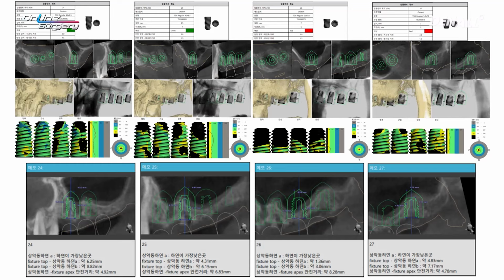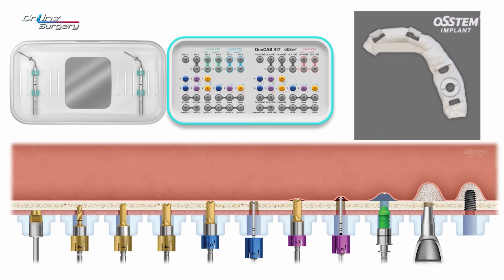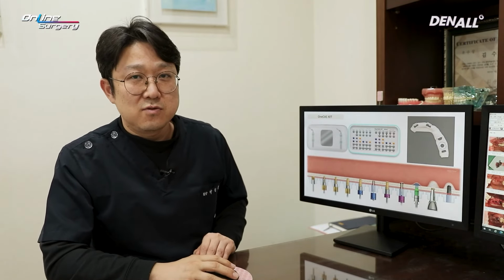If you look at the guide design, this shows everything we need to know about residual bone. This shows the minimum and maximum distance up to the inferior margin of the sinus from the implant top. We can anticipate the basic numbers. Also, a guide is presented following these numbers as to how we should drill. You can look at this document and proceed with surgery in a very safe manner.